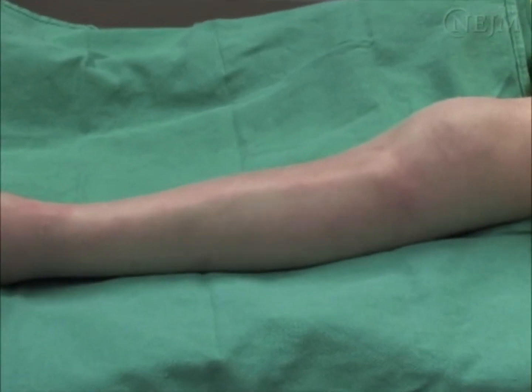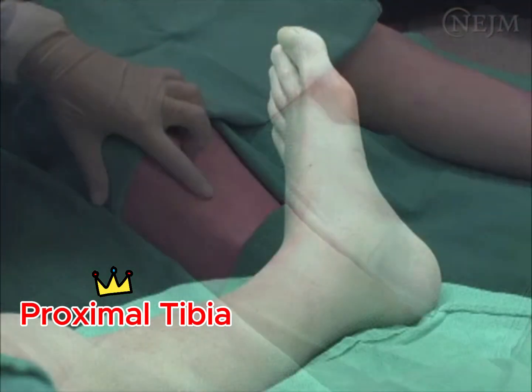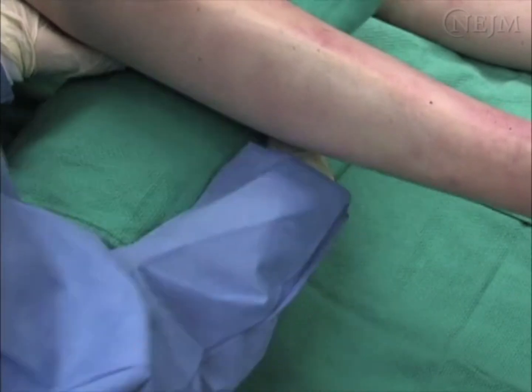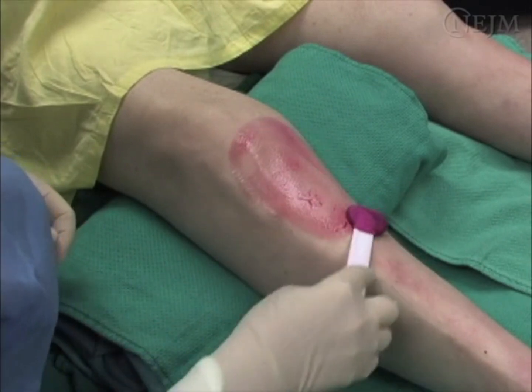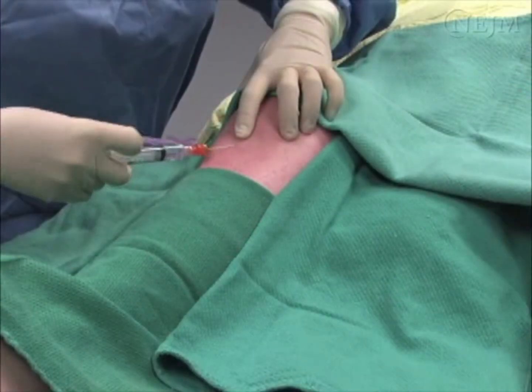When a mechanical device is used, the proximal tibia is the preferred site in adults. Secondary sites are the distal tibia and the humeral head. Position the patient's leg in slight flexion by placing a rolled towel under the knee. Don sterile gloves and expose and clean the site with chlorhexidine or iodine solution. Then drape the site in a sterile fashion.